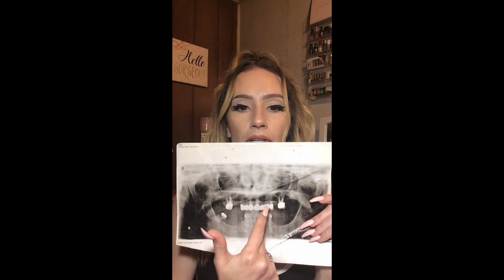So anyways, lastly, I will show you an x-ray of my teeth from before I had them pulled. This is pretty close to what I had on surgery day. It's a really old x-ray, but this is what I had. So you can see the roots of the teeth where my real teeth were. These upper molars I had, they were root canaled and crowned. And then I had this tooth and this tooth, and then I had this one. But this one and this one, they're cemented together, and then these three are too. So there's no tooth in the middle. It's just a fake. The bridge fills in the gap.